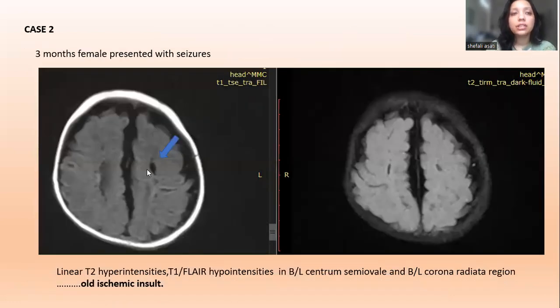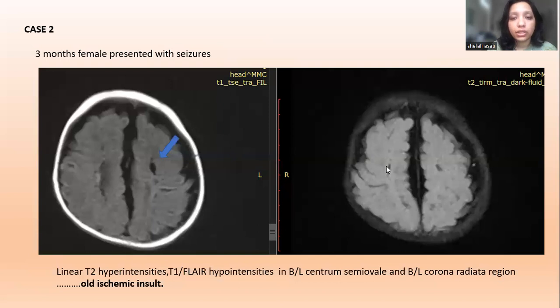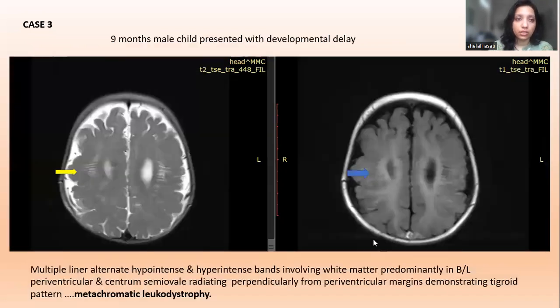Case 2: A three-month-old female child presented with seizures. On T1 and FLAIR sequences, there are T1 and FLAIR hypointensities noted in the bilateral centrum semiovale and bilateral corona radiata region, likely representing an ischemic insult.